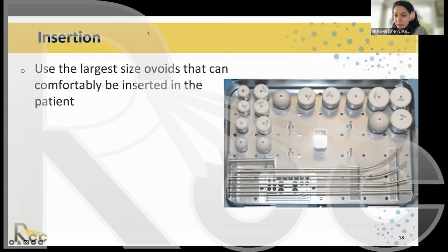Thank you so much. Adaku is asking, with the C-arm, can we see when our applicators are not properly placed? Again, it is a little bit more difficult.